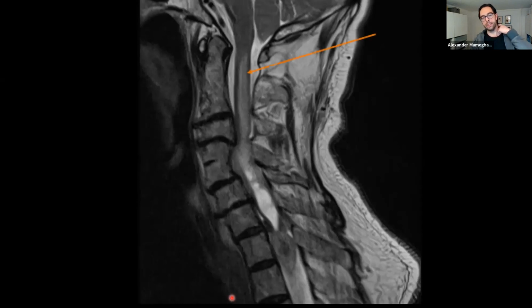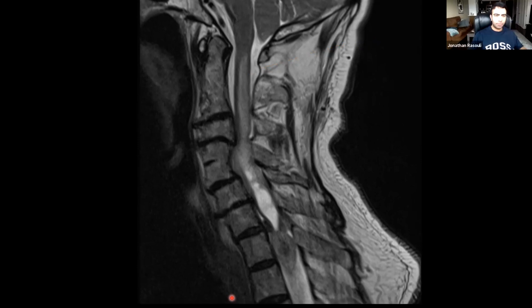Oh, thank God for MRI in this case, right? Because imagine if you didn't have the MRI and say the patient had a contraindication, had a pacemaker or something. There's no way we would be able to know this on a CAT scan alone. Yeah, this is a great case. Thoracic spine with and without contrast too. Alex, this is an impressive, super nice case.